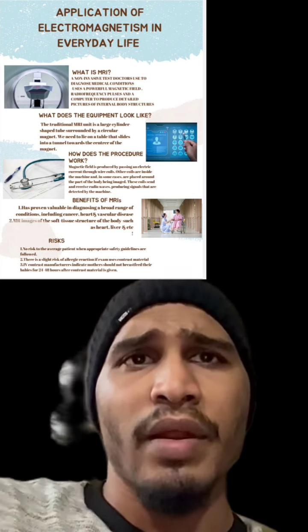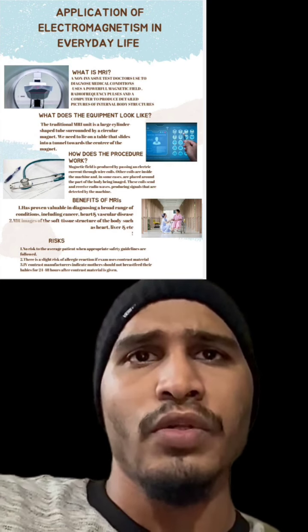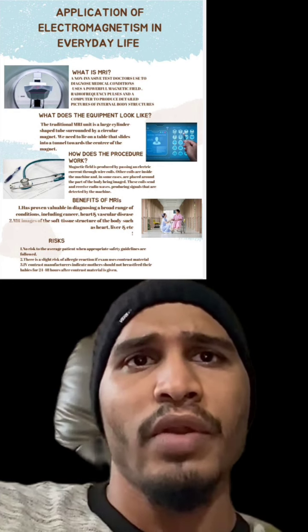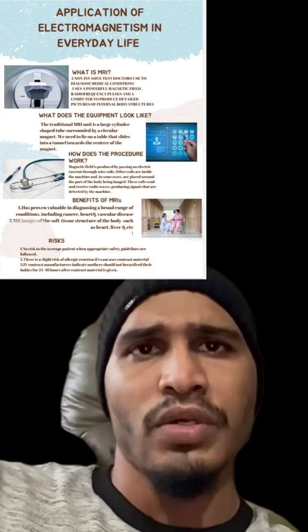In the brain, MRI can differentiate between the white matter and gray matter and can also be used to diagnose aneurysms and tumors. Because MRI does not use X-rays or other radiation, it is the imaging modality of choice when frequent imaging is required for diagnosis or therapy, especially in the brain. However, MRI is more expensive than X-ray imaging or CT scanning.